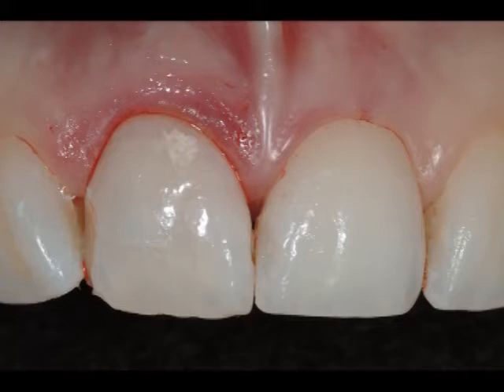And what you'll see now in a still photo is the immediate post-operative clinical view and case complete periapical radiograph.